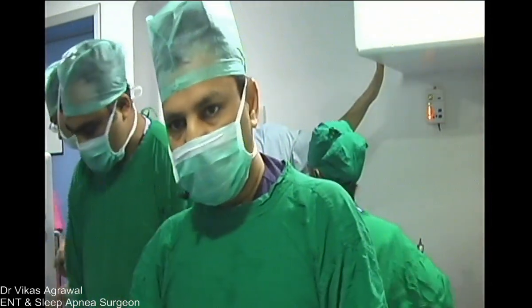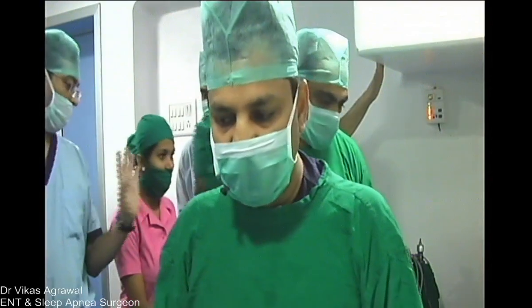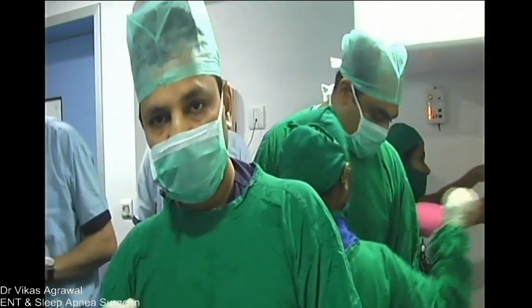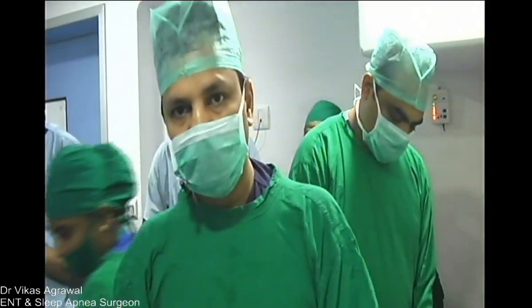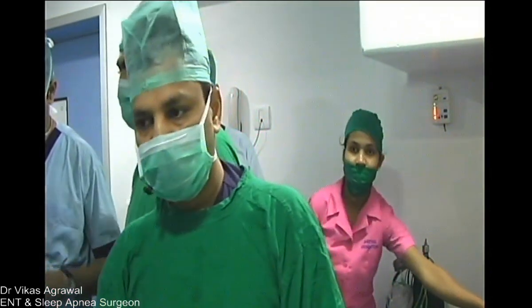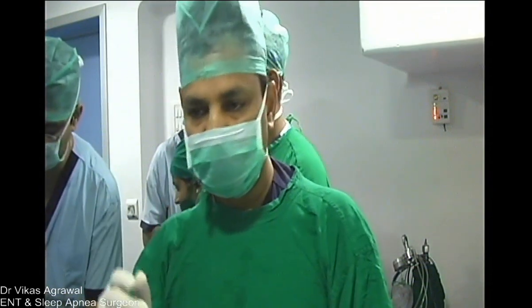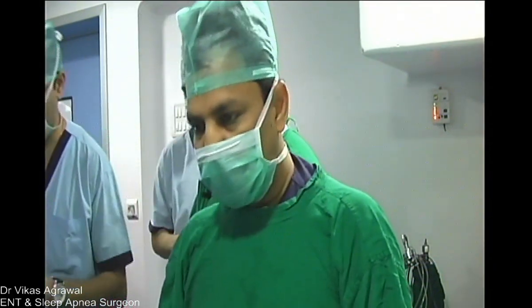So even if I do not put any throat pack while doing uvulopalatopharyngoplasty, it's fine because it's only saline. But if you're not sure that water will go inside, then you must use a throat pack. And because we anticipate some blood to trickle down while doing septoplasty and turbinoplasty, a throat pack is a must in almost all the procedures. Only while doing the tongue-based surgery, we have to remove the throat pack because it's that same area that we are operating. So we'll do the uvulopalatopharyngoplasty first.